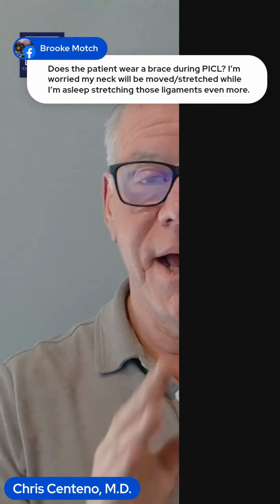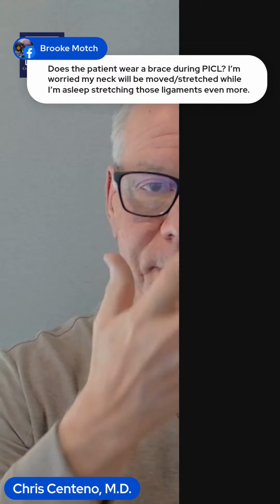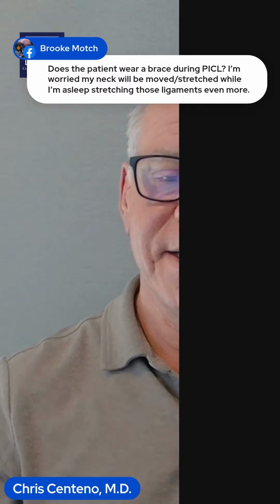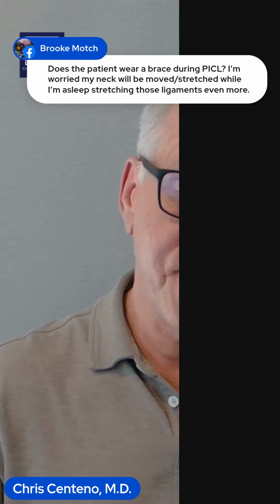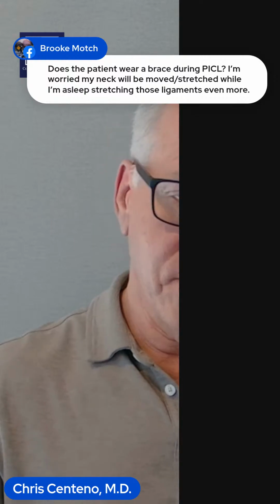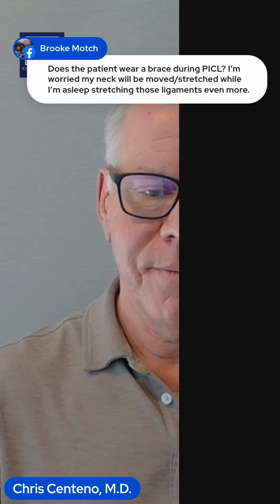That's not the worst thing in the world, but it would mean that we could only do the things that we can accomplish with your head straight, which would be most of the PICL from the front, and then the midline ligaments and let's say 1-2 facet joints from the back. We wouldn't be able to do other things that we normally do because many times that requires small turns of the head to accomplish that.